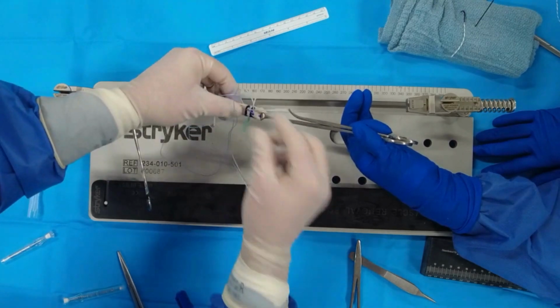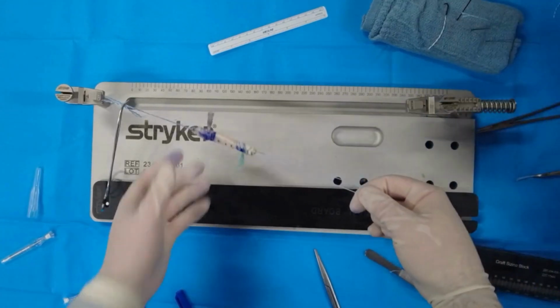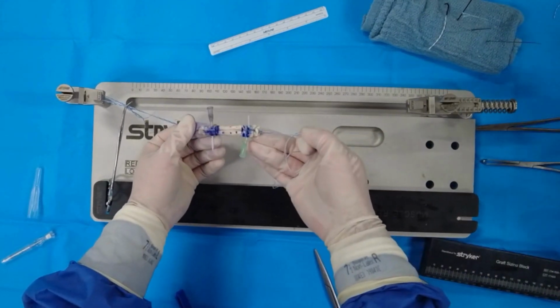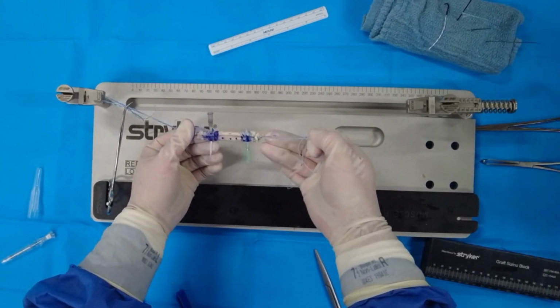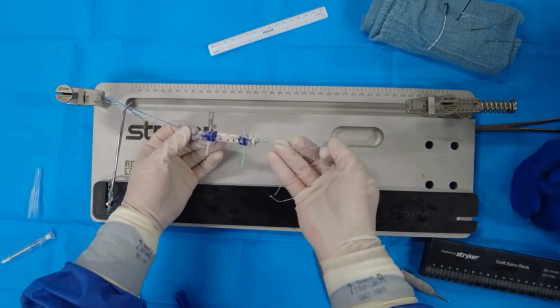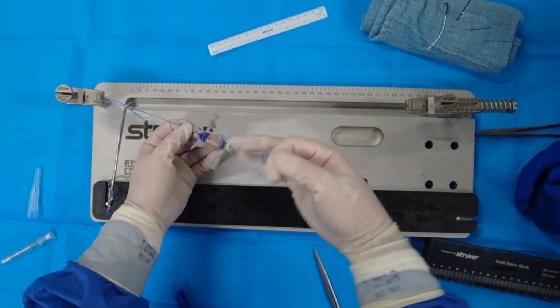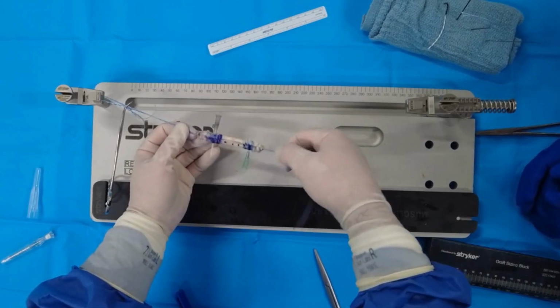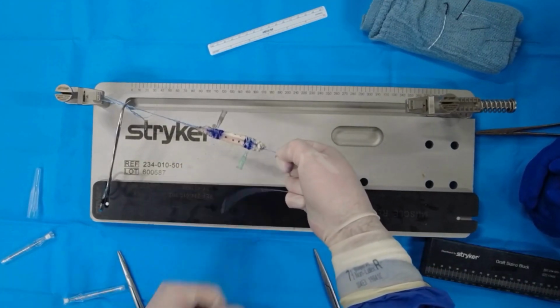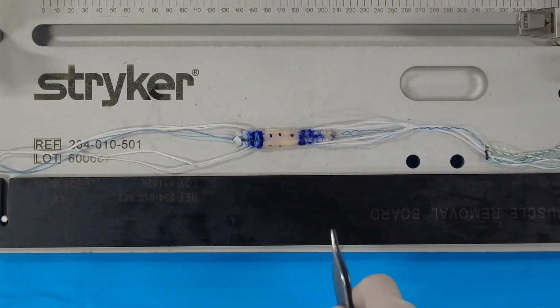We're going to go ahead and do this similar technique, and this is our finished product. You'll see that it nicely maintains our ribbon-like morphology, which, as we understand more about the ACL, may have much less of a bundle as it is a ribbon-like structure, which is another benefit for the quadriceps tendon and doing this technique. You'll see this is incredibly stable to testing.